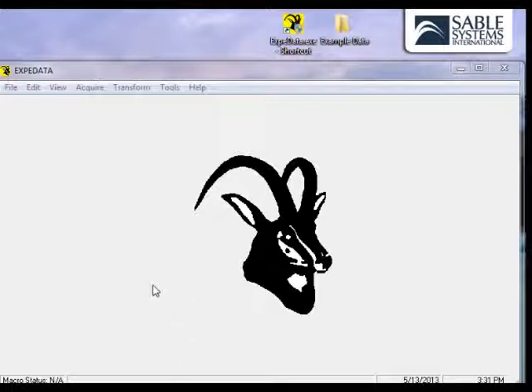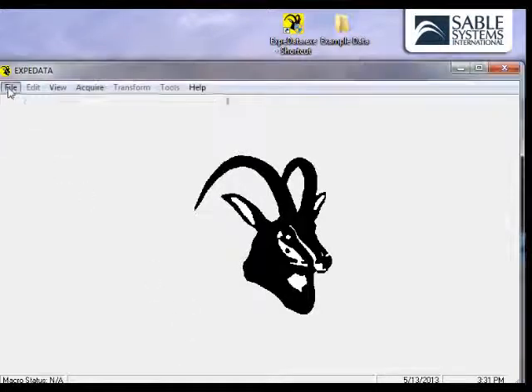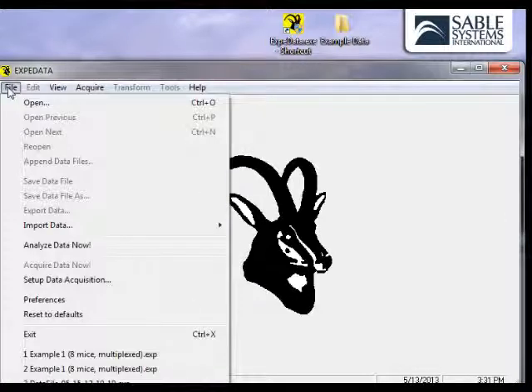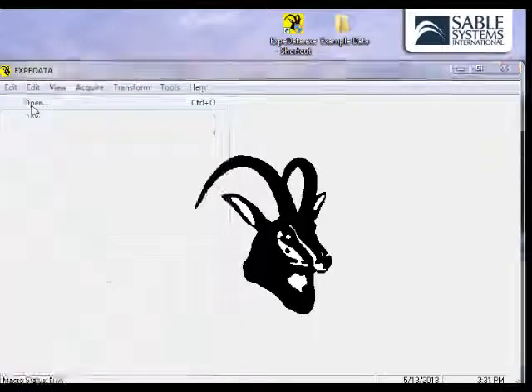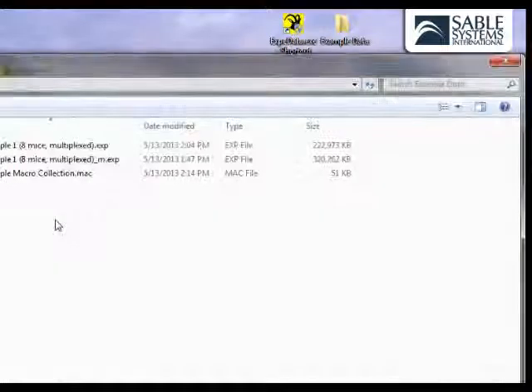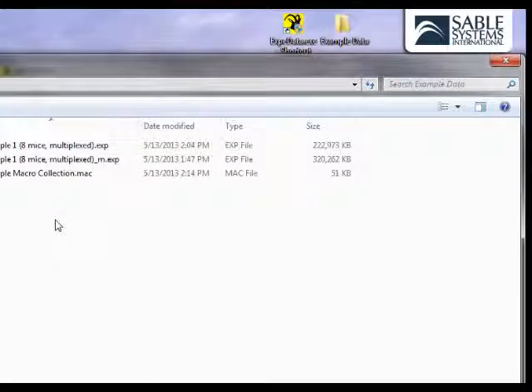To do so, simply click on the File menu and then click on Open. This will give you quick access to the typical data file.